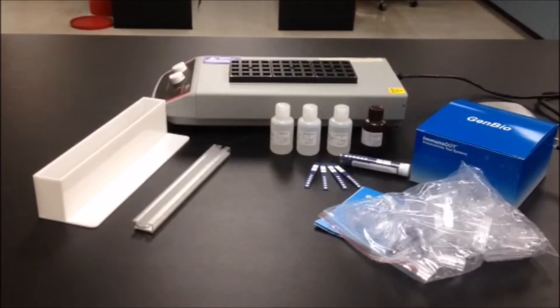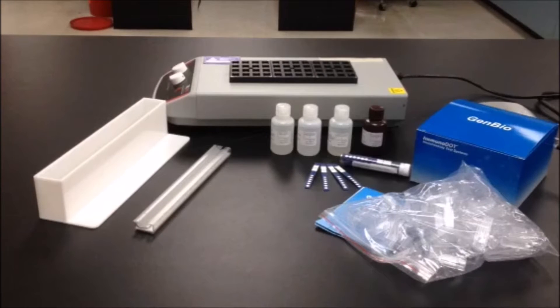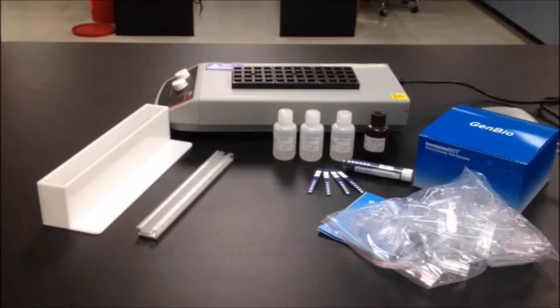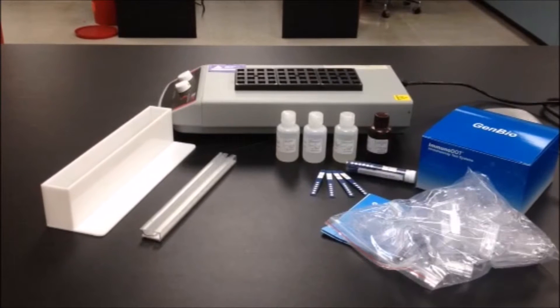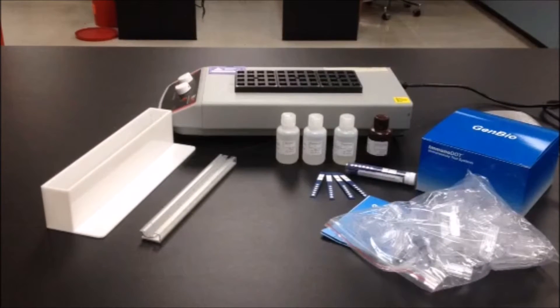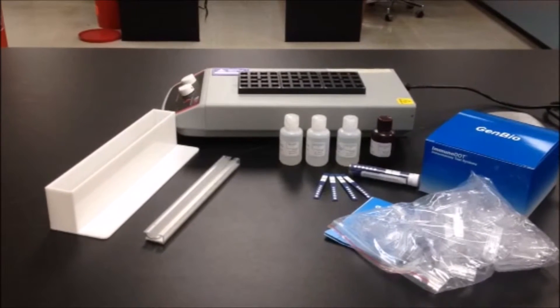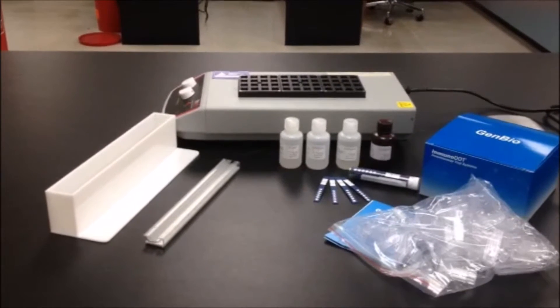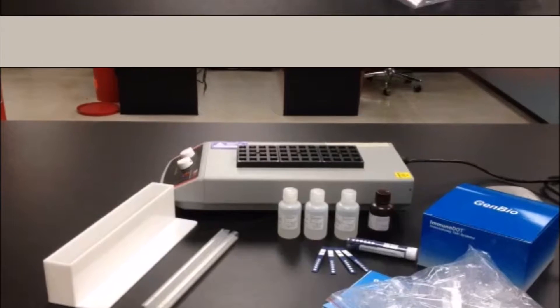The immunodot immunoassay test is a dot blot assay where specific antigens are spotted onto a nitrocellulose-based reaction strip in order to simultaneously test for the presence of multiple patient antibodies as an aid to diagnosis of infectious or autoimmune diseases.